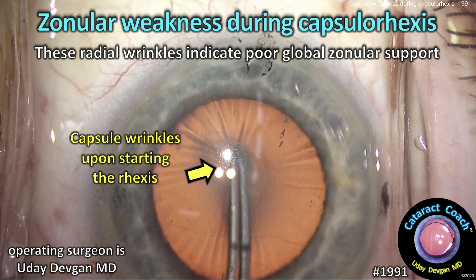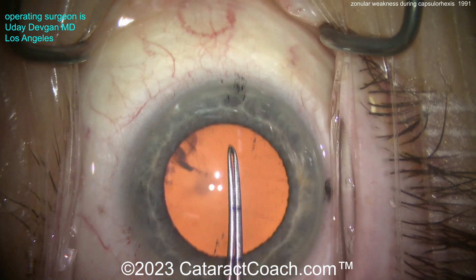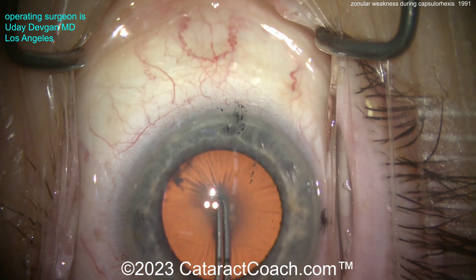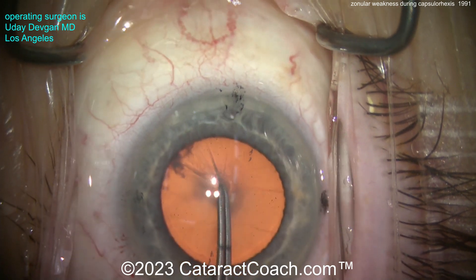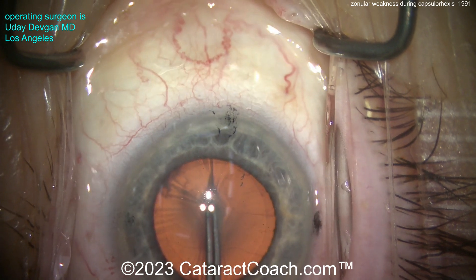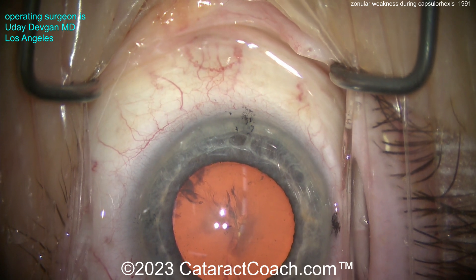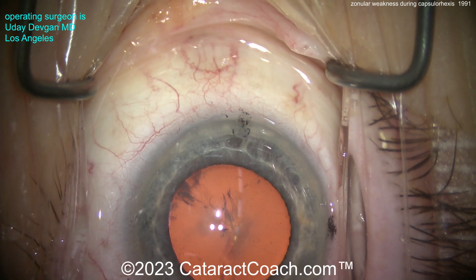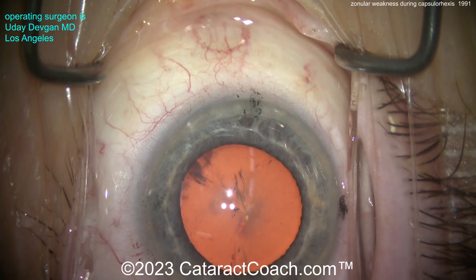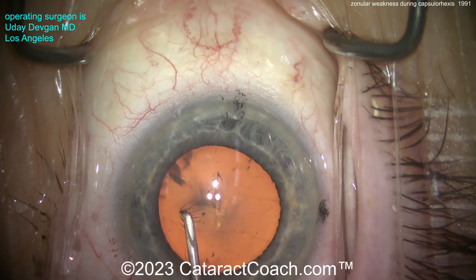cataractcoach.com. Zonular weakness during capsulorhexis. These radial wrinkles indicate poor global zonular support. Let me show you the case here. Relatively small eye, about a 5mm pupil. We try to poke in with the forceps — this is what I always do — and look how loose the lens capsule is. It's so loose that I'm unable to poke in with my forceps, like I do 99% of the time. So that's a good hint that there's global zonular weakness. I'll use a sharp cystotome to puncture the lens capsule.